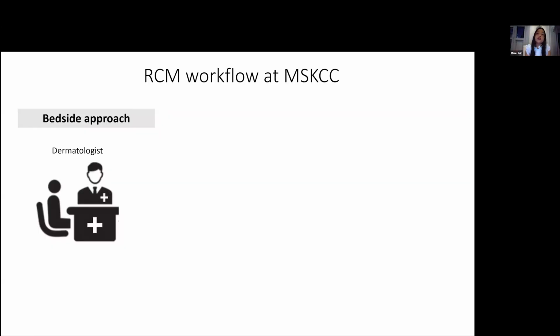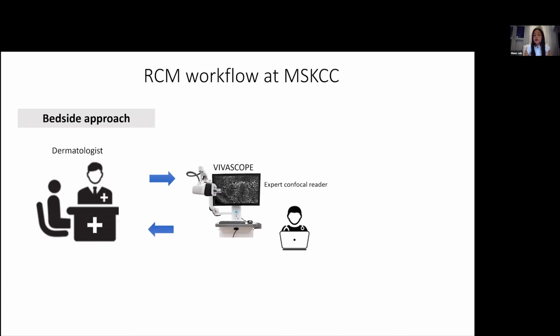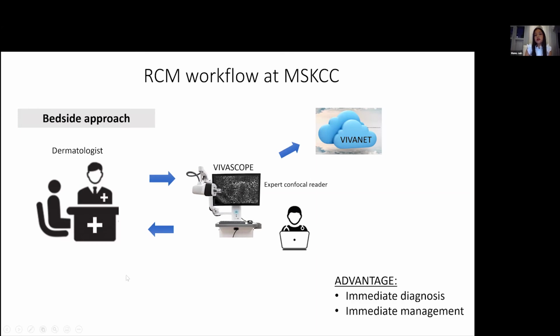Now, how we are using it at MSK is we are diagnosing patients at the bedside. What does it mean? If a clinician has a patient, he or she will send them for confocal within our department, and an expert will read these images and give the diagnosis there and then. The whole procedure happens within 20 minutes. That's excellent because you can also store these images in the cloud and look at them later, but we do the bedside approach. The advantage is you can give an immediate diagnosis to the dermatologist, the patient is relieved, and immediate management can be made.